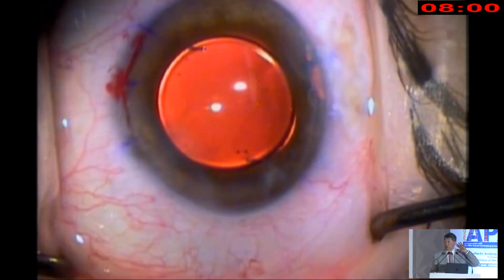Someone suture it? All right, someone's doing this. So how many people want to test it and jiggle it? How many would jiggle the eye? Okay. How many people think, we've done enough, we don't want to know anymore, would not jiggle the eye? Raise your hand. How many people would not jiggle the eye? Okay, yeah, you know, this is how we do it. How many people wouldn't jiggle the eye, but want to see what happens if I jiggle the eye?